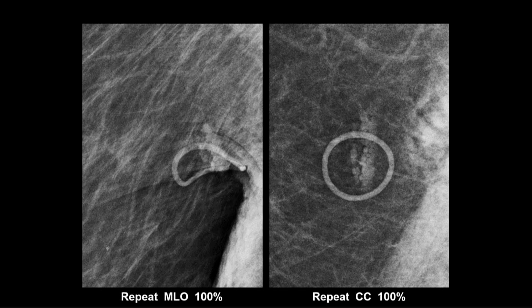The patient never noticed it because she doesn't lift up her breast and look underneath there in the mirror. So we recalled it. But you could have, but I would have preferred seeing such an irregular finding, even with the air. You suspect that it's on the skin.